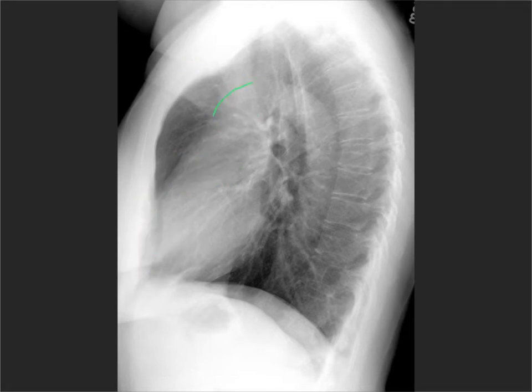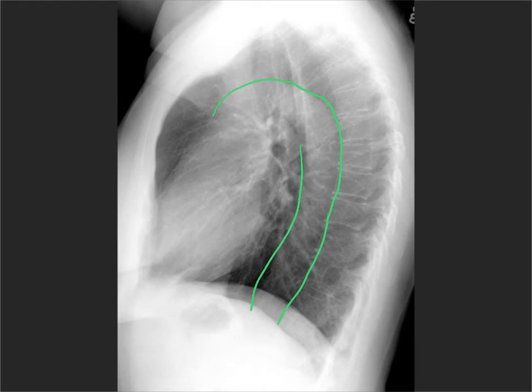Sweeping round, we have the aortic arch followed by the descending aorta. Whether you see the entire aorta or not depends on how large and ectatic it is, and whether it's positioned posteriorly against the vertebral bodies — as in a younger person — or whether it waves more anteriorly, as in older people, where you see it better.